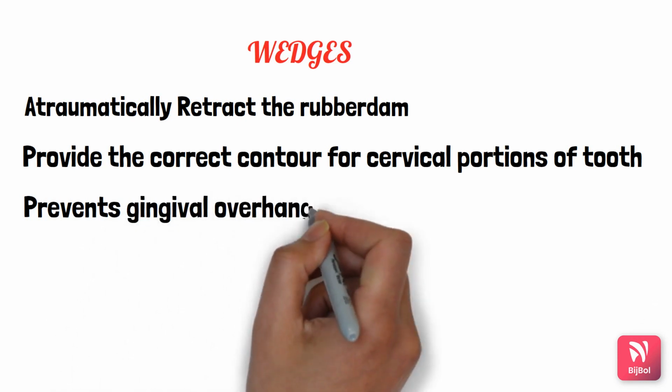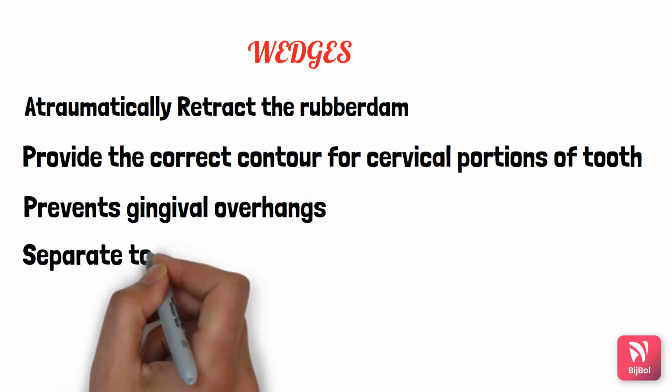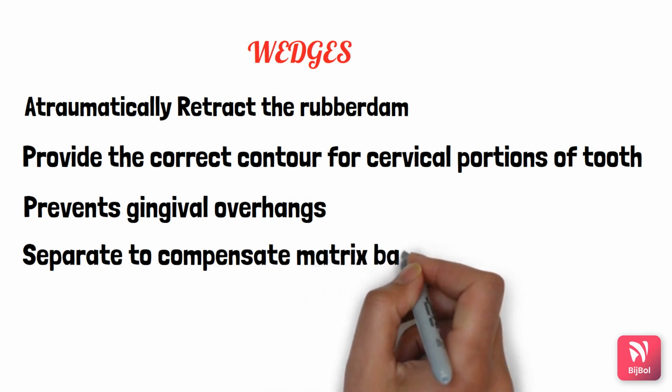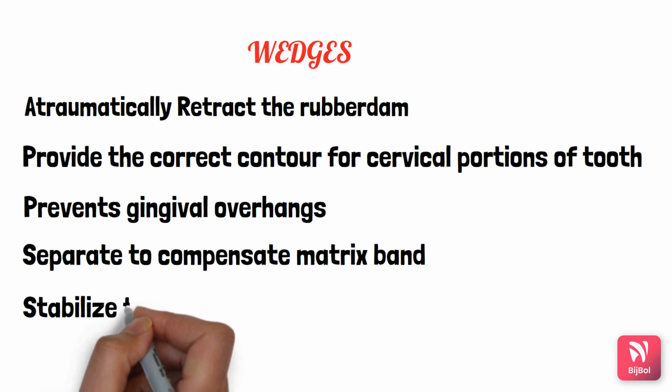They separate the teeth to compensate for the thickness of the matrix band, and also help in stabilizing the matrix band and the retainer during condensation of the restorative material.